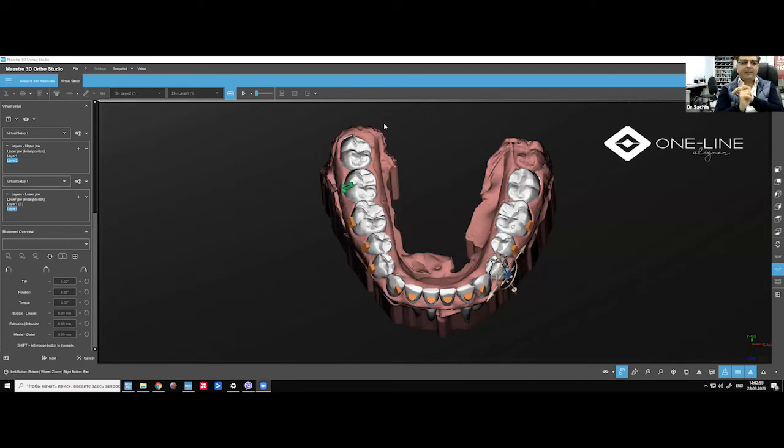So let's say you asked me about translation and rotation, right? That's a good question. So in my case, I use multiple layer sheets. Rotation is 2.5 to 3 degrees normally. In some cases, with smaller teeth, I'll go to 1.8 to 2 degrees.